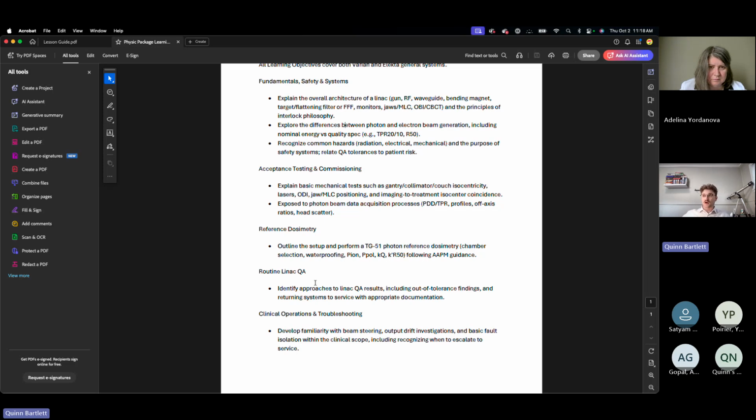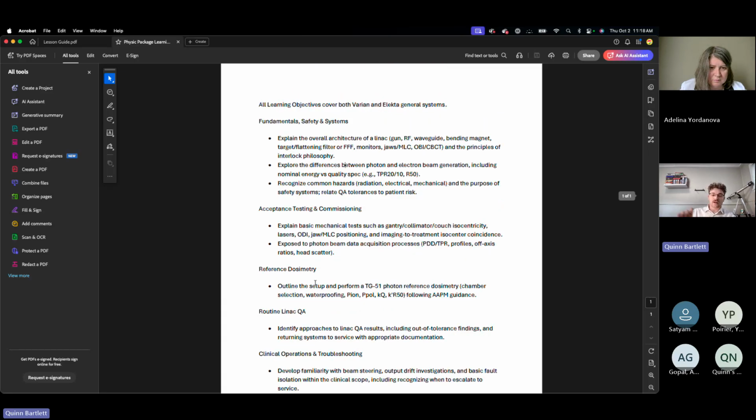And there'd be some other things we can cover supplementary, but these are the main ones that we really can cover. And so I am working on getting this up on the website on the pricing page, so when people are looking at the product, they can see this. But at the same time, this is something that can be shared with anybody. We'd be happy to share with anybody to either understand what they can teach with it or learn some new things that they can teach with it. And maybe I can get it up into that student resource portal as well. So that would be great.